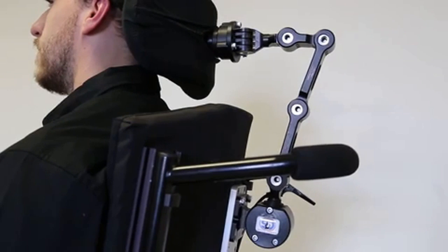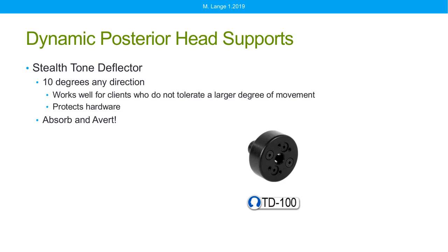For this particular person, the amount of force is going to vary depending on how many links you have. If the head support is sitting higher up, there's a little more leverage.